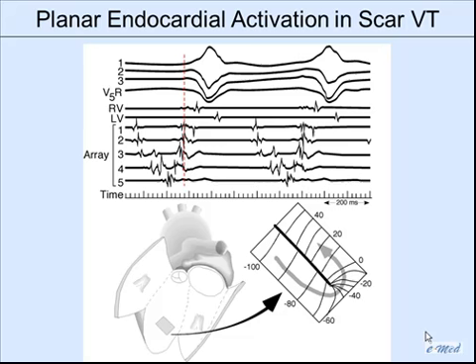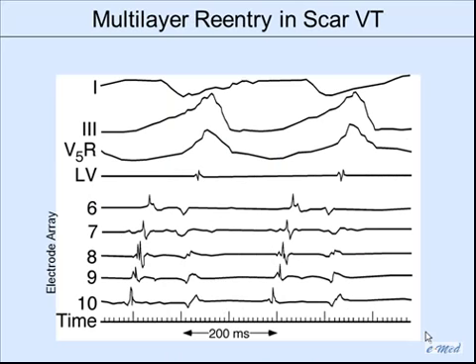We also had multipolar electrode arrays. Here's one on a septum. This is a 4 by 5 bipolar array, so 20 bipolar pairs in about just a few centimeters squared. And you see a couple of things here. One is this is a diastolic propagation here, and then there's another wave that goes along here. We didn't understand this very well at the time.